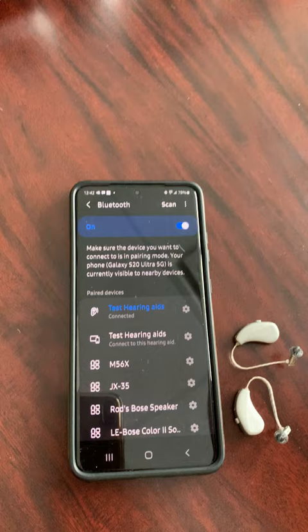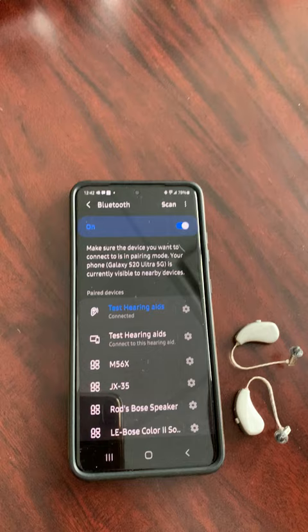Now with the hearing aids directly connected, you can stream phone calls, video chatting, music, any media — whether that's Facebook or Instagram videos, and anything like that.